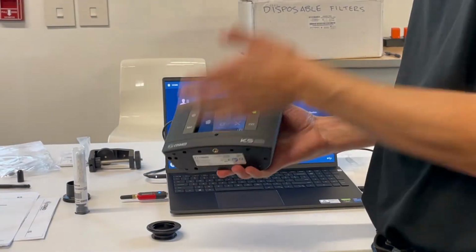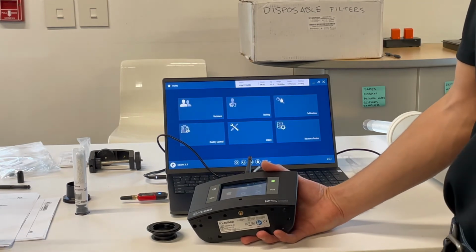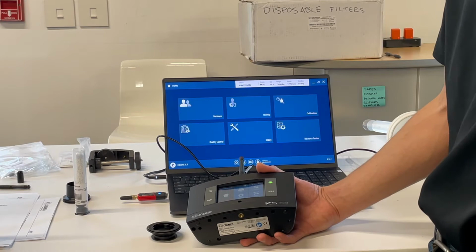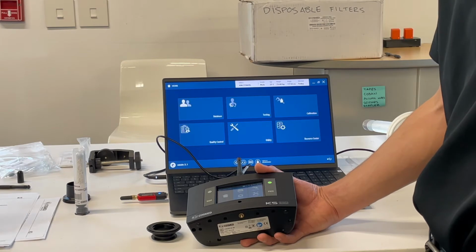The hospital or the university is really fussy about any personal health information getting stored on a laptop. So if I say it's going to be stored here and then swiped, it's going to drop onto the laptop to be configured and then taken onto a secure USB and not stored on this.